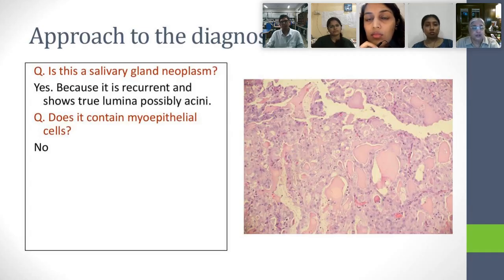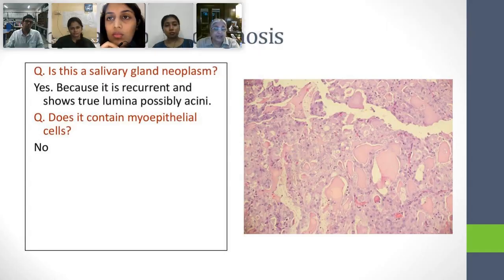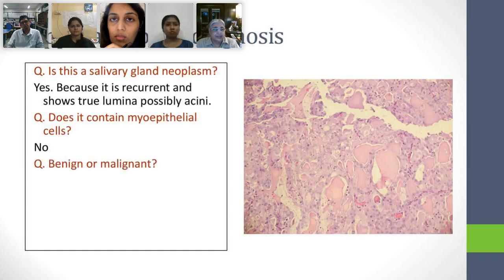You never saw anything that looked like a myoepithelial cell in this tumor. It's not spindly. There is multivesiculation, but there is no clearing. These are not clear cells. There were no hyaline cells. There was nothing that you would be able to look at and say, I think that is a myoepithelial cell. Next, now comes the question, is it benign or malignant? And how do you answer that question? You can either go and match pictures like you did, okay?